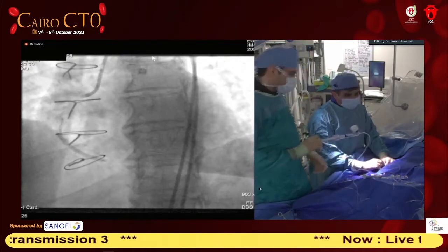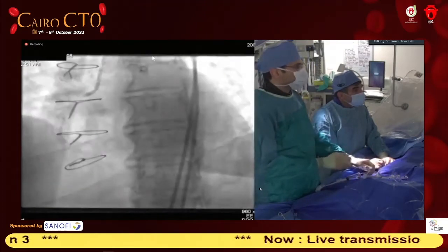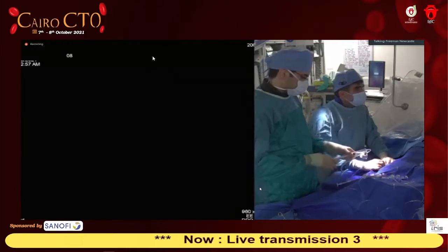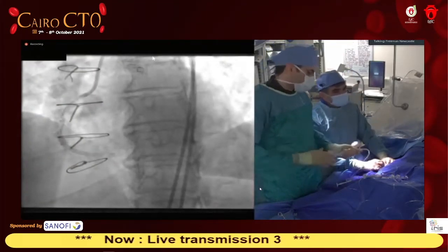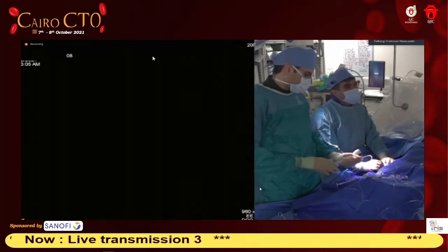I'm only deploying at 12 to start with. Have a little test, and then it could go higher if we need to. Okay. Go up again. 12. 16.